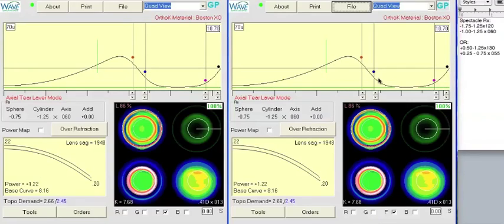The second option to address the cylinder exactly, I think, makes more sense theoretically to me, but really it is theory. And to be very frank and honest with you, the mechanics I'm going to show you right now are just theory to me. I have not tried this on a patient. I've anecdotally heard of some patients who've been treated this way, but I've personally never seen any post-wear maps to see what it looks like. And so all this is possibly just more for discussion, discourse, for education, and hopefully at least it'll spur some ideas for you.